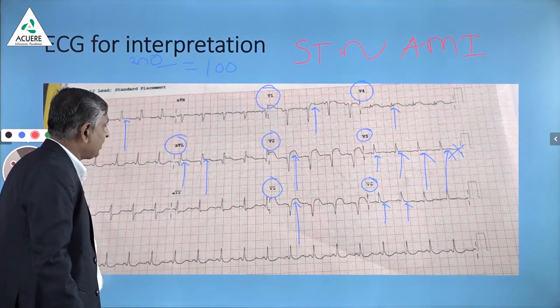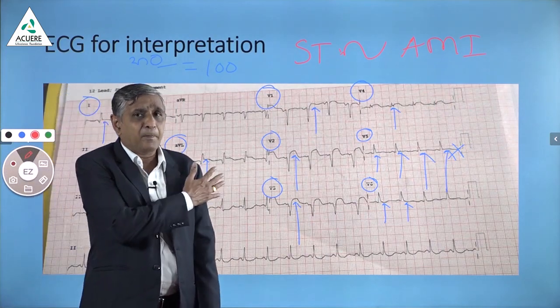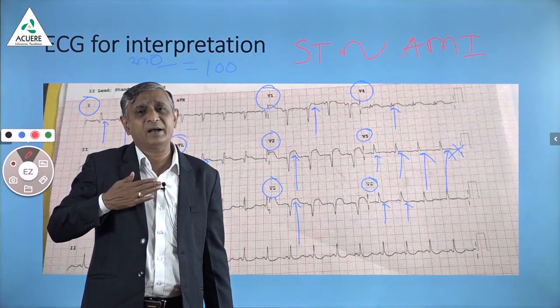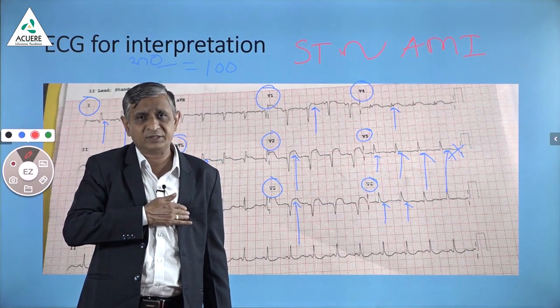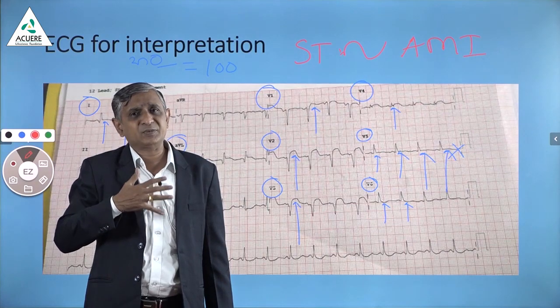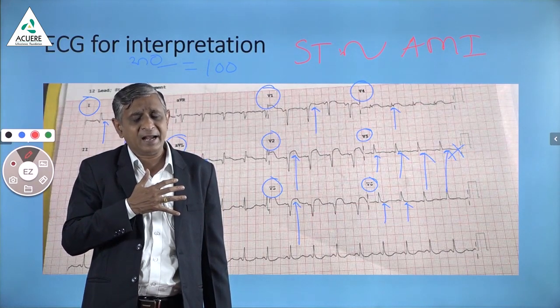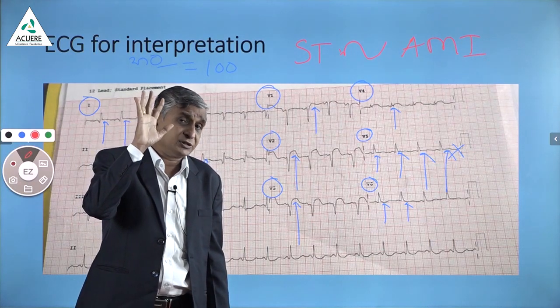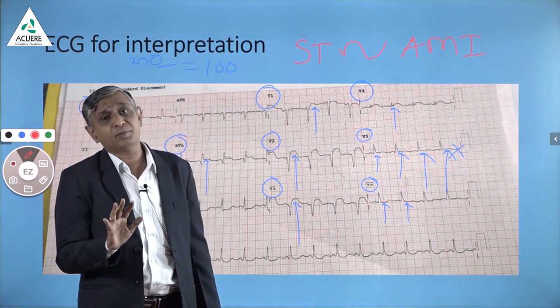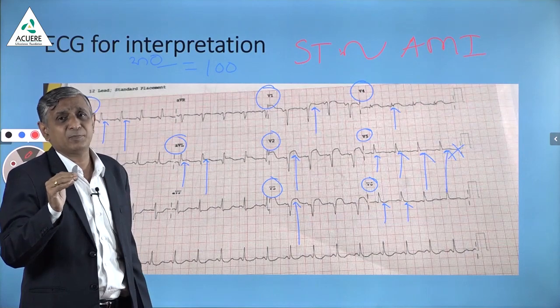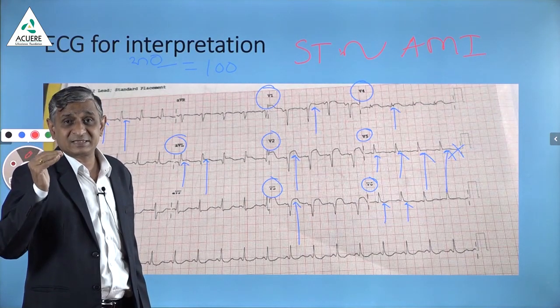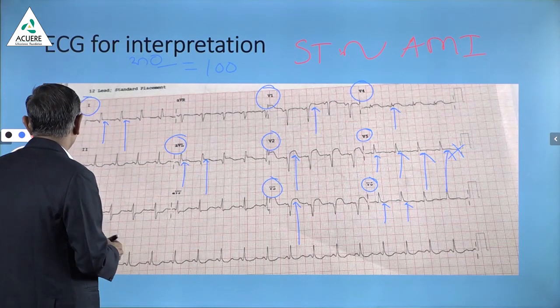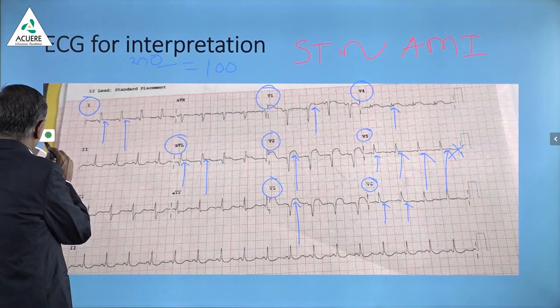The upper and lateral portion of the heart as well as the anterior portion — V1, V2, V3, and V4 — are all affected. This ST elevation alone is not sufficient; it must be supported by ST depression in other leads.